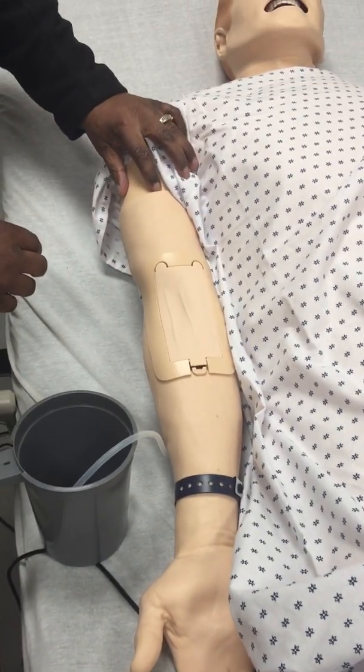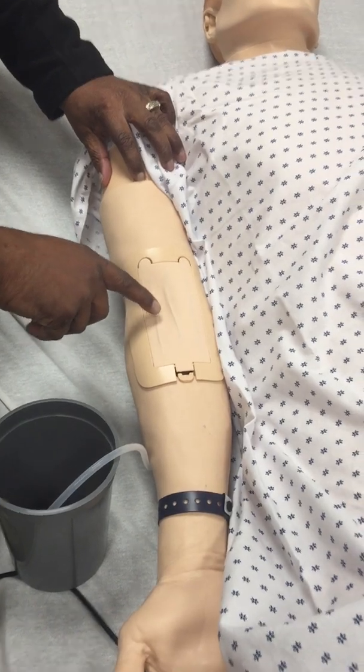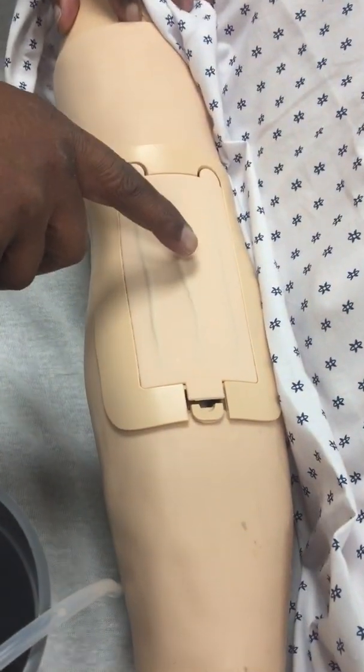We're going to depress the button down. You see the veins start to change — you can see them more superficial than you saw them before.